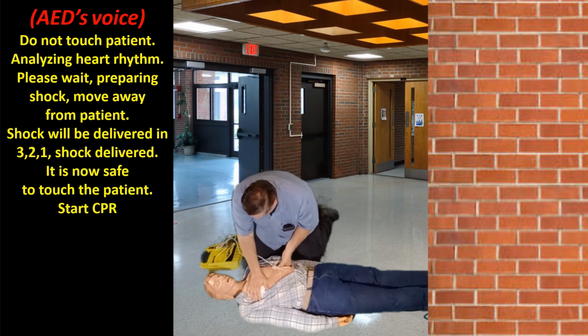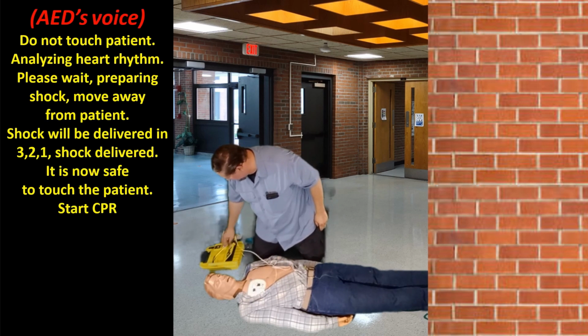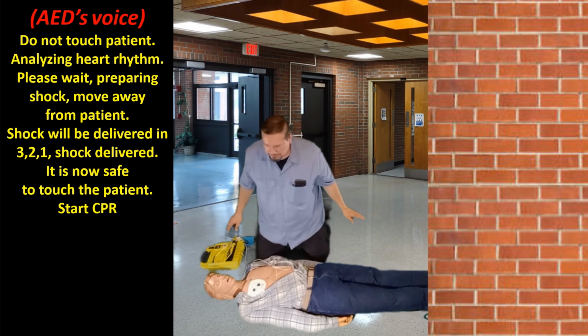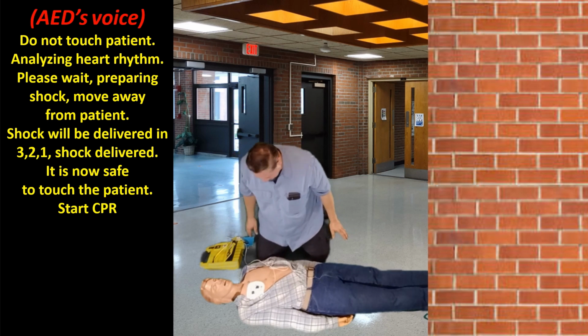Do not touch patient. Analyzing heart rhythm. Please wait. Preparing shock. Move away from the patient. Shock will be delivered in 3. Okay, stay clear. 1. Shock delivered. It is now safe to touch the patient. Start CPR.